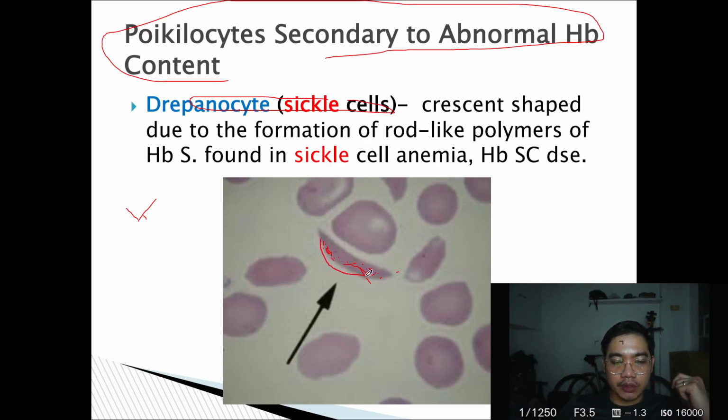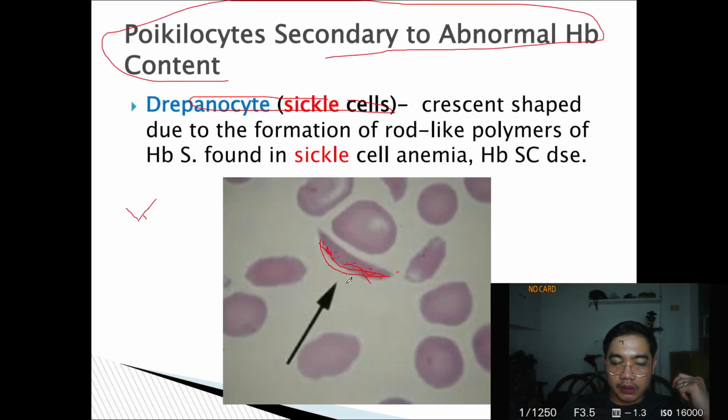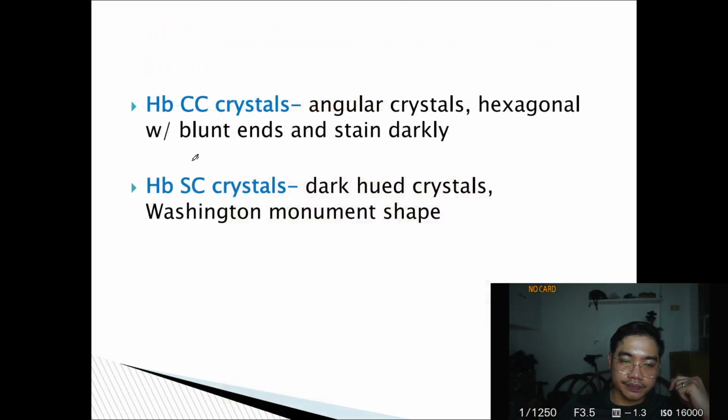That's why it becomes a sickle drepanocyte. Problem in drepanocyte, since bati silang nawong sickle, once they flow into tight blood vessels, they tend to clog it, no, leading to ischemia and necrosis.